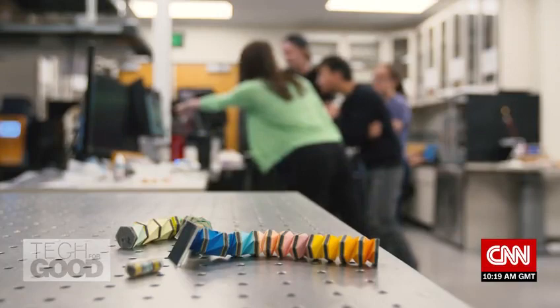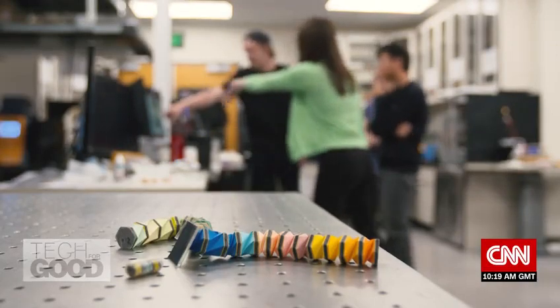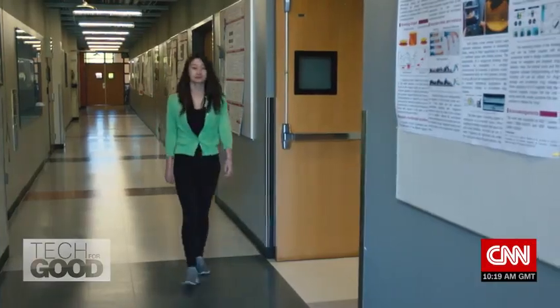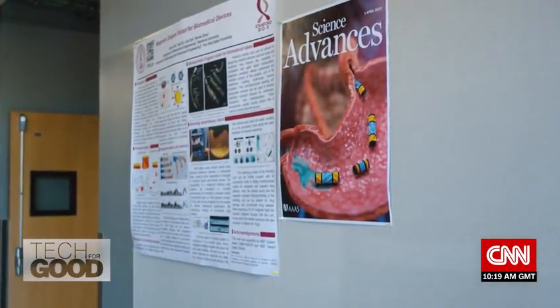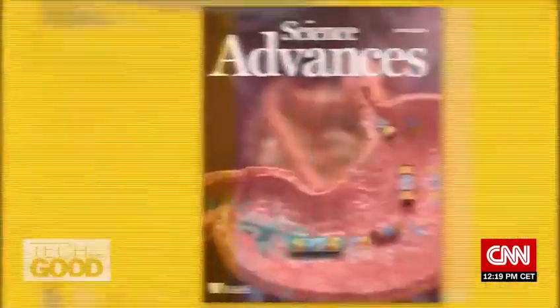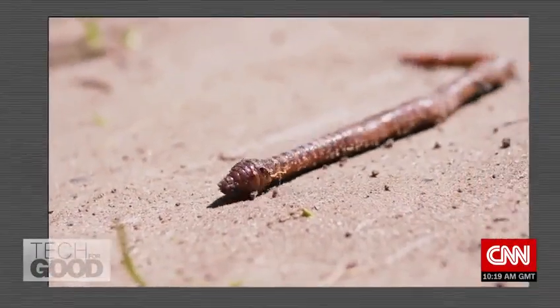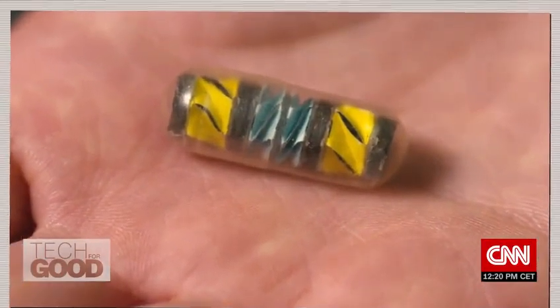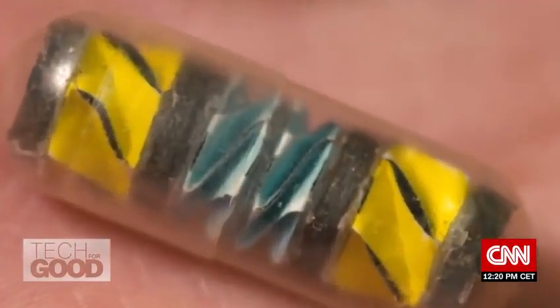The octopus arm is only one of several designs Zhao and her team are developing that could have broad biomedical applications. In April, Zhao's work with the so-called crawler robot — based on the movements of an earthworm — was featured on the cover of Science Advances journal. The lowly worm doesn't get much respect out in the real world, but in Zhao's world of biomechanics, the earthworm is a rock star.